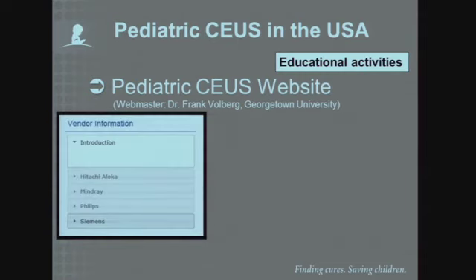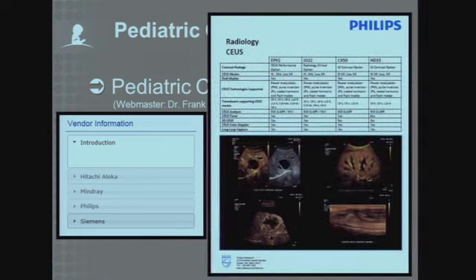And we've also asked the vendors to become involved in our website. Most of the vendors, if not all of the vendors, now have contrast specific software packages that are available for purchase to be used on their equipment. And we've approached the vendors and asked them to share the technical information about what they do have available for contrast ultrasound on their equipment for the SPR membership as a reference.